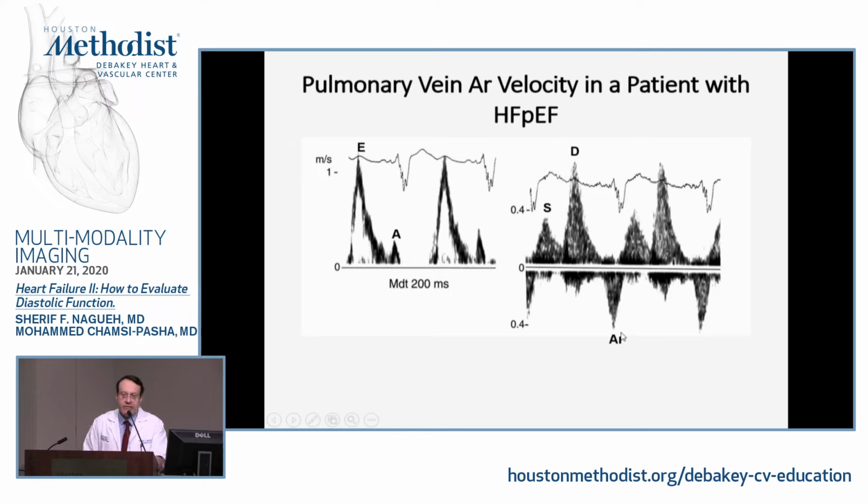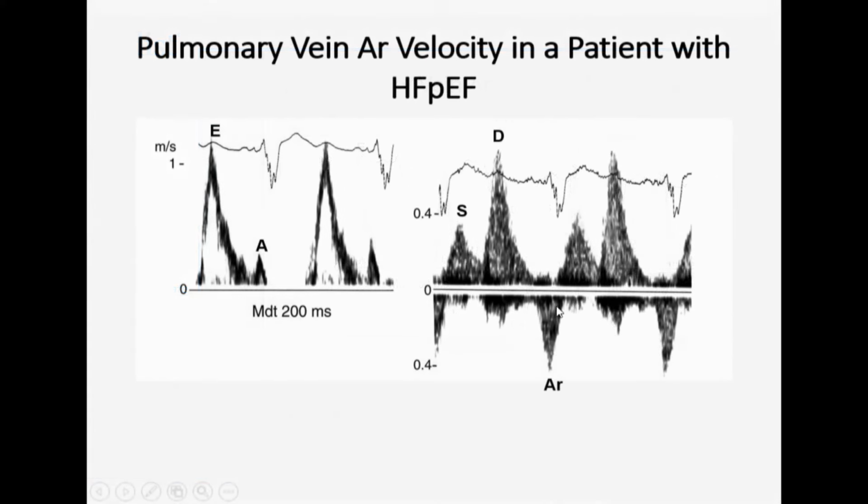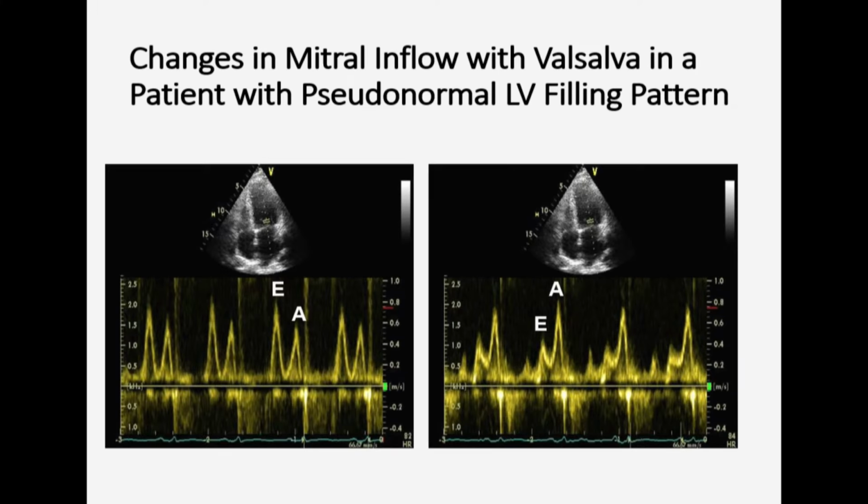So an atrial reversal velocity that is at least 30 centimeters per second with a prolonged duration compared to mitral inflow is a good, solid indicator of increased EDP and diastolic dysfunction. The peak velocity and the duration of that atrial reversal is not age-dependent. As someone ages, provided they have normal diastolic function, this velocity doesn't change its amplitude or duration. Hence the importance of recording pulmonary veins in all cases, and the feasibility in ambulatory patients should easily be in excess of 85%.